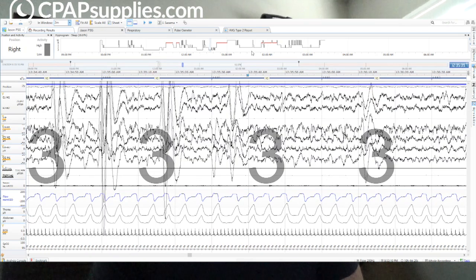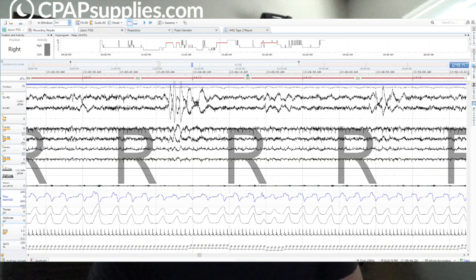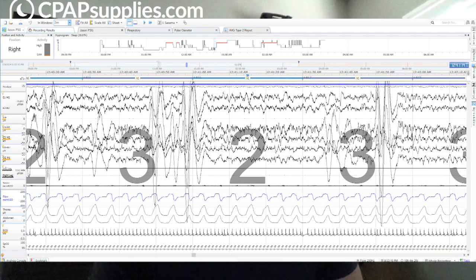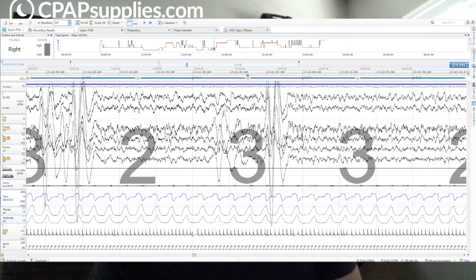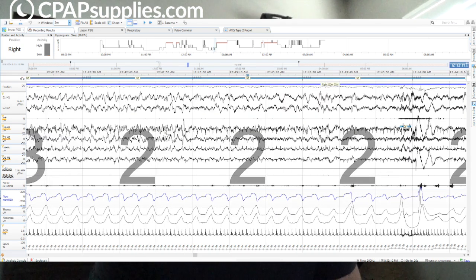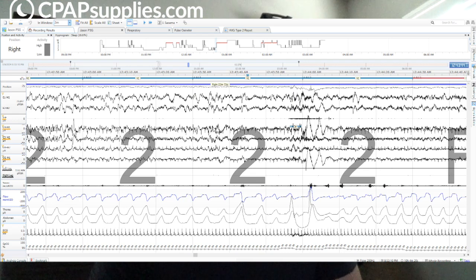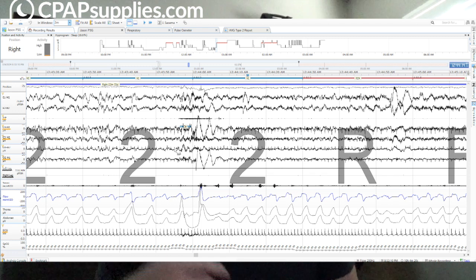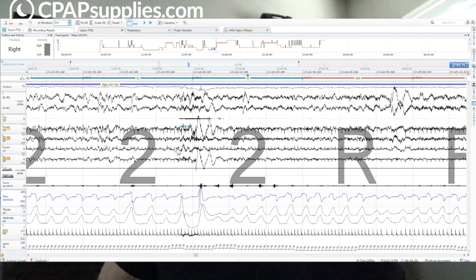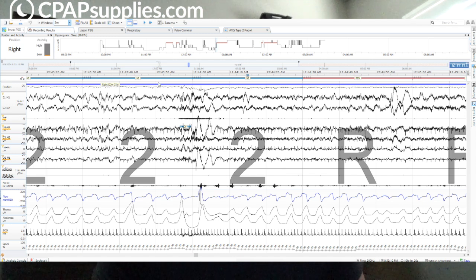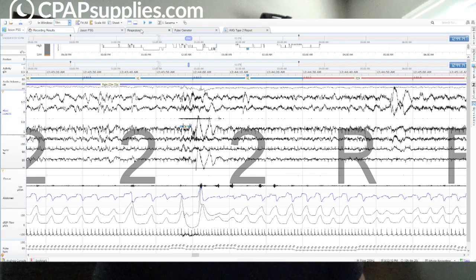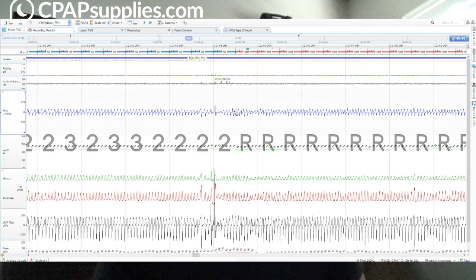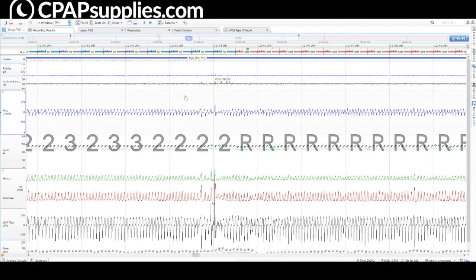Kind of interesting stuff here. So let's go ahead and move forward to this. So we have more REM. Let's check out that transition again. The transitions are always kind of interesting. Let me show you something else here. So stage two, stage three, mixed. Kind of back and forth being stage two, stage three. Watch how it flattens out. All of this really starts to attenuate, gets flat. We have a random arousal. What? A lot of you I've done PAP analysis with, like right before REM sleep. You'll see this random arousal, this massive, zoom out again. You see this big, weird looking thing and it's like, what the hell happened there? I don't know why, but always before REM. It's like my video window just cut out. But always before REM, you'll see this massive, like this little awakening.